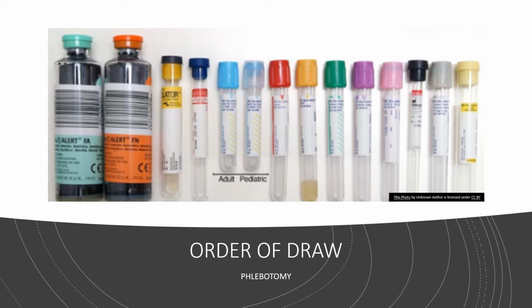It can lead to misdiagnosis of a patient, because as you go through your phlebotomy class, you'll start to learn that doctors use our lab results along with other diagnostic tests such as x-rays and MRIs, along with physical and history, to be able to diagnose, monitor, and treat our patients. So if we're giving them results that are not totally valid due to crossover contamination, and we'll get deeper into this as the slide goes on, then we can put out false test results.